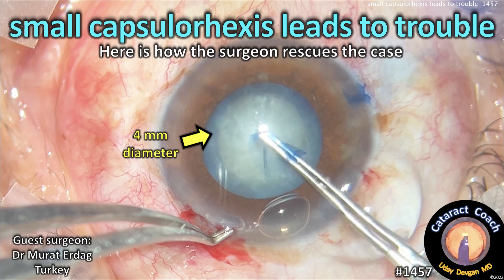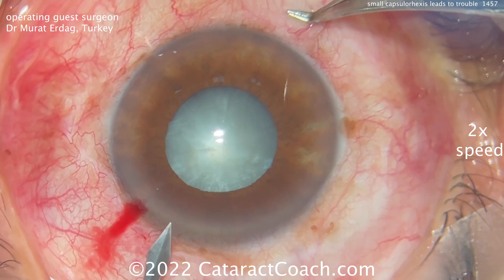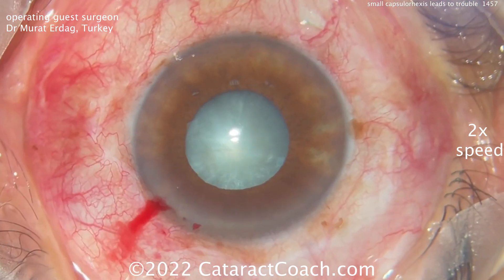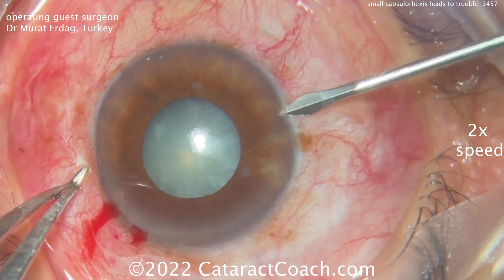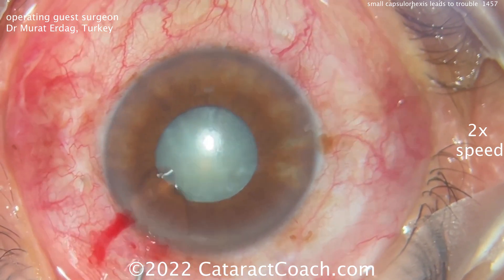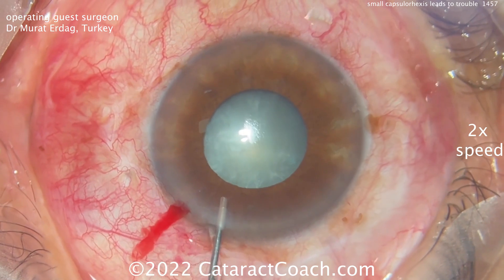CataractCoach.com. Small capsule Rhexis leads to trouble, but here's how this talented surgeon rescues the case. Our guest surgeon is Dr. Murat Erdag from Turkey. This is a smaller eye with not the best dilation, and a small Rhexis is going to happen here.